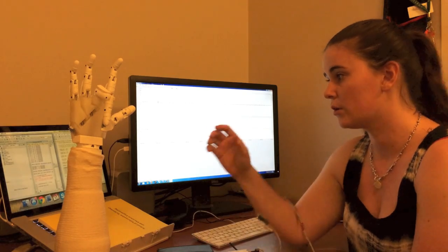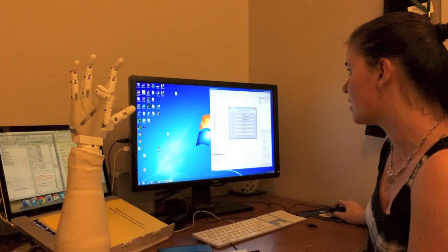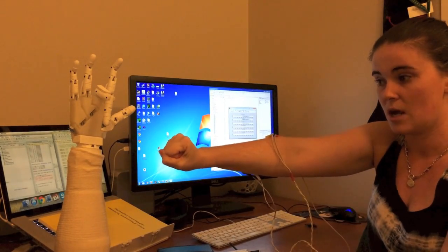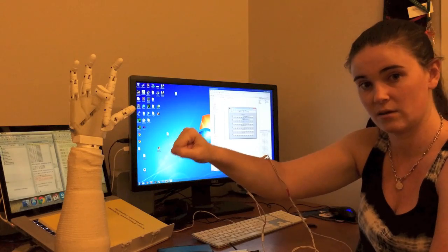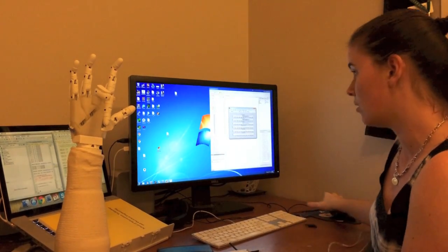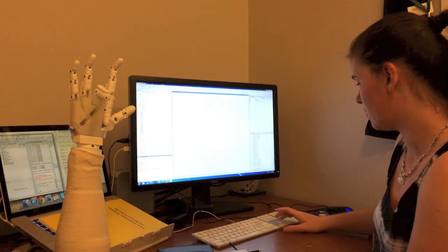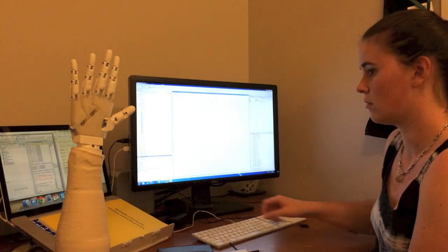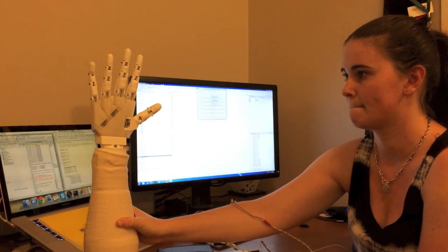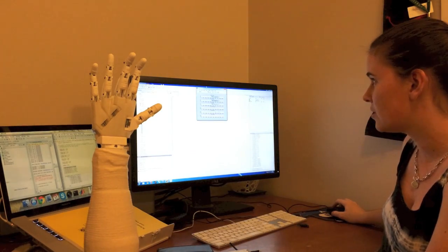So what I'll do is I'll actually run some of the code. I'm going to run code that takes a clenching motion. And so with that data, the clench motion, the arm will now clench as well. So as you can see there, that was just a basic clench motion.